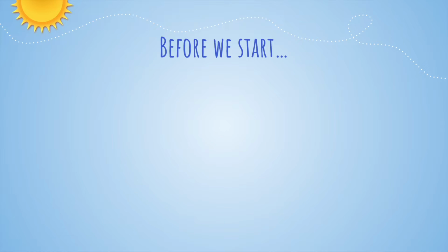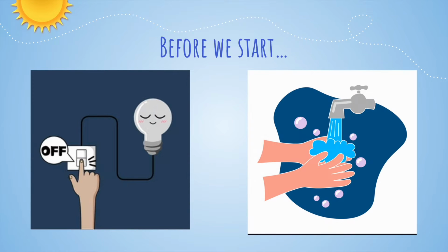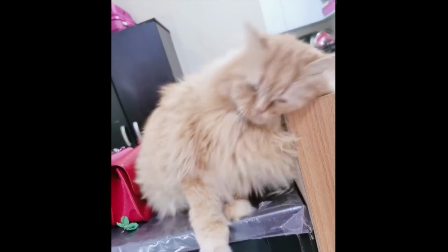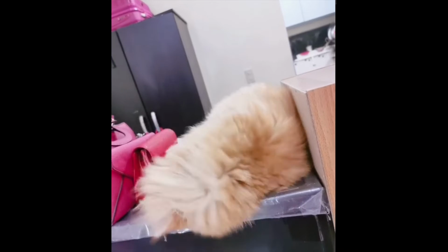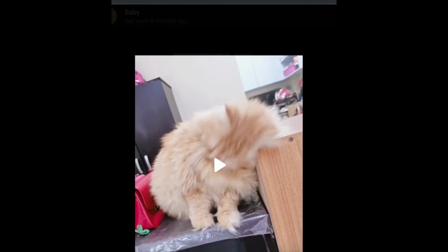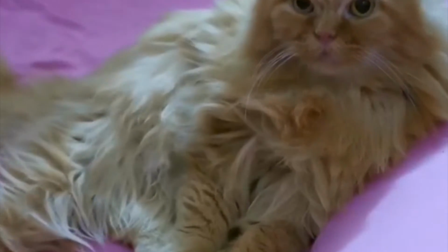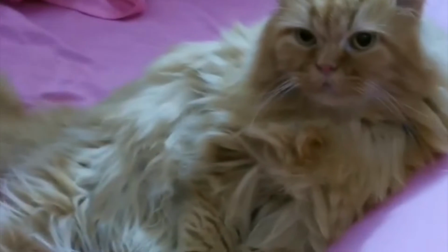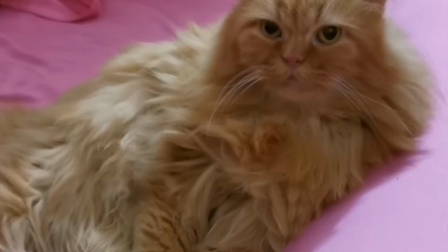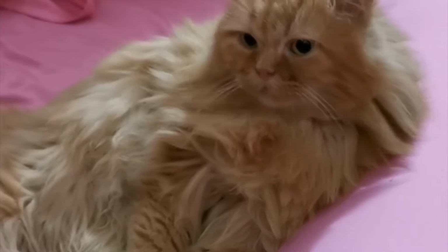Before starting the procedure, we must dim the lights and make sure to wash our hands properly. We might encounter different types of patients, like slightly cooperative children or totally uncooperative children. For a slightly cooperative child, you can pretend to play to gain his trust and cooperation. For a totally non-cooperative patient, you can ask the parent to hold the child and let him sit on the lap, and wait for the child to calm down and relax before you proceed with the examination.